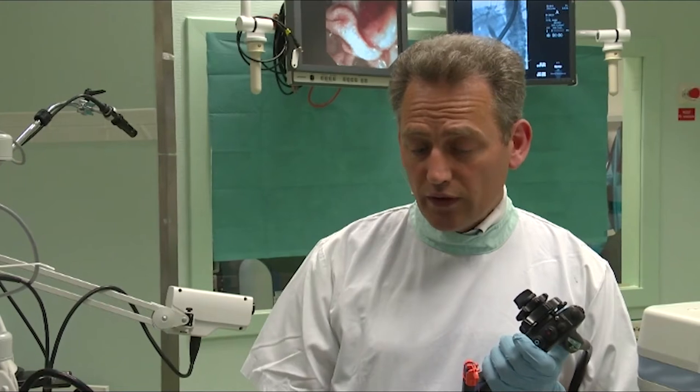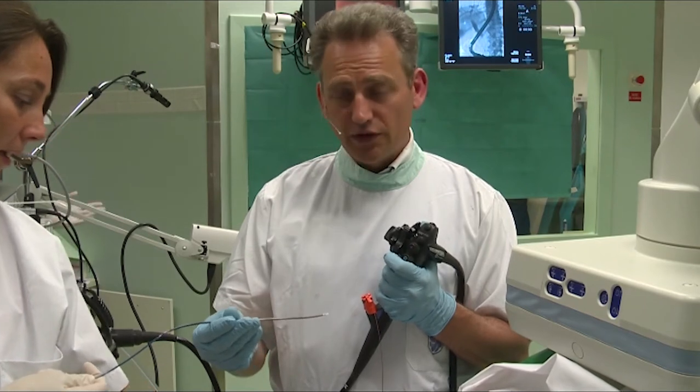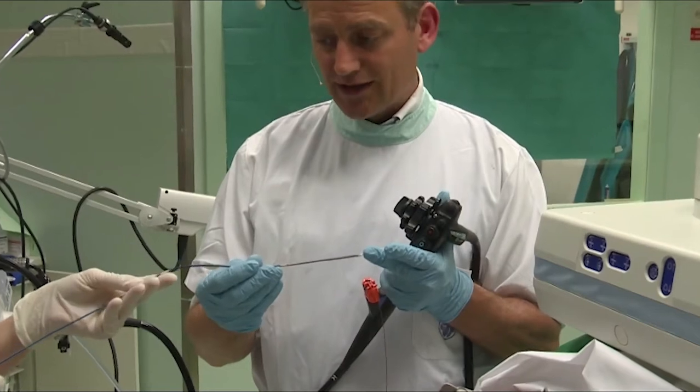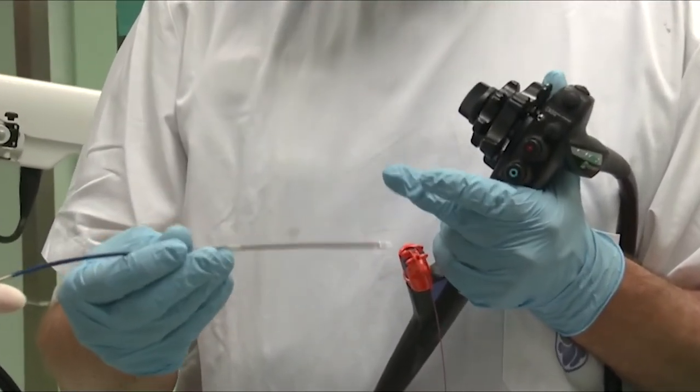For that reason, we should place a metal stent, and a metal stent that we will introduce as a new evolution, uncovered metal stent. We will take the 6 centimeters, please. Okay, this is the stent that we will place in this patient, the new Cook Evolution stent. This is an uncovered version, 6 centimeters. And it's interesting just to talk you through the new device and its features.